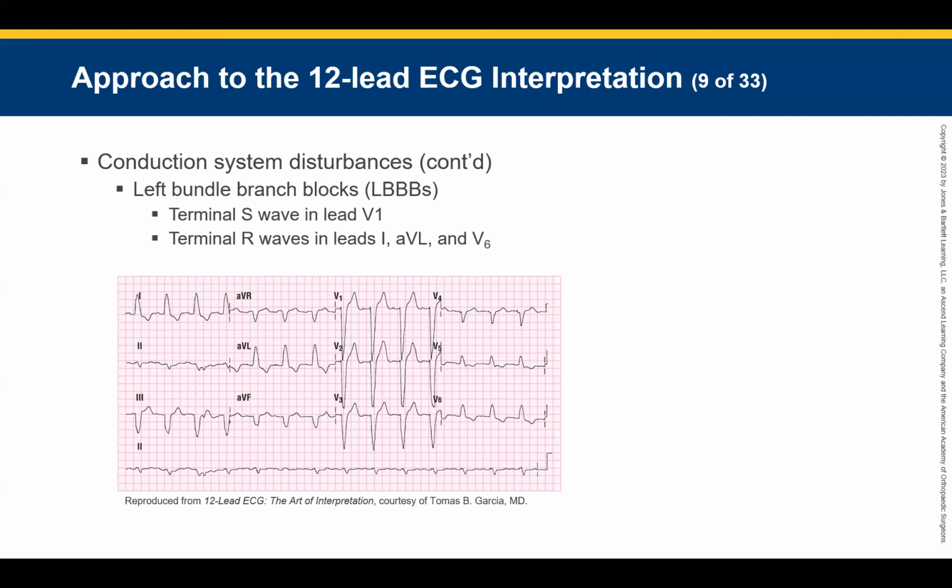So I guess I'm confused about what I'm looking at and want to determine. Say that again. You're confused on what? Like, looking at D1, I guess I'm just confused on what I'm actually looking at to determine the bundle branch. Okay. So you're looking at the width, the beginning of the QRS to the end. Even if we just said, hey, that's the end, and that's the T wave, that's more than 5 boxes wide, right? Yeah. So you're more than 5 boxes wide, you have a P wave here, P wave there, P wave there. So does that make sense?